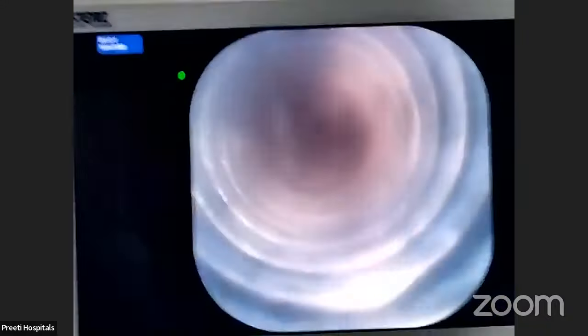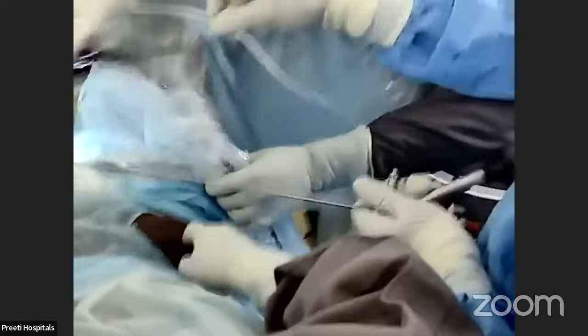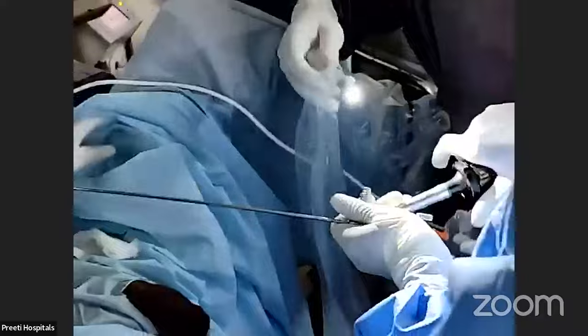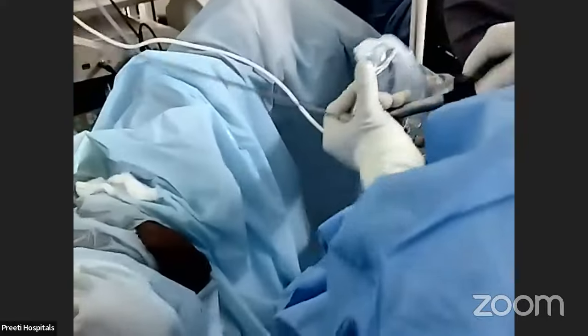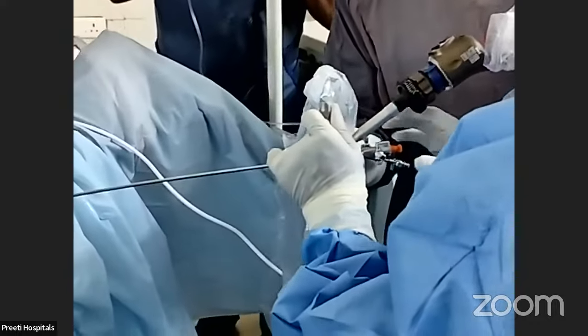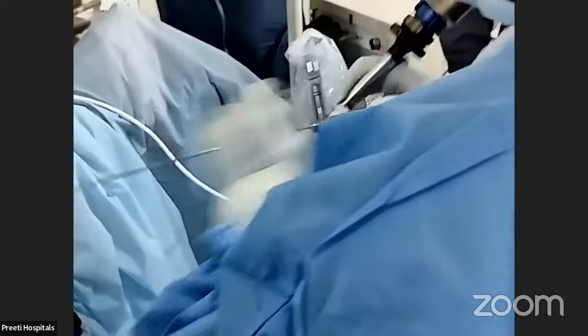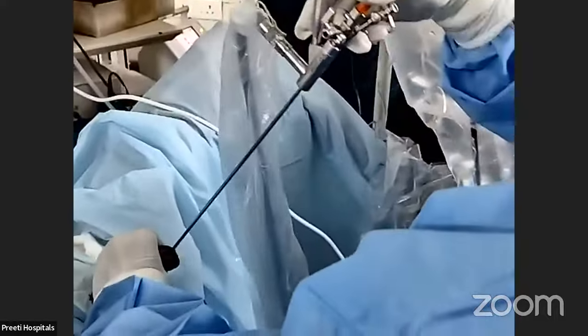Yeah. So I am in the bladder. So I will take out and do ureteroscopy and then again do it. Give me the ureteroscope. The other option for me, because it is live demonstration, we can have this type of problem. Because it's post-stented, I was confident that I would be able to pass. So in post-stented also, sometimes this access sheath may not go. So I will do the ureteroscopy and then decide what to do. If you have the large 9.5 access sheath, that will pass. We will see that. In that case, we will not be able to demonstrate, only show the external genitalia.